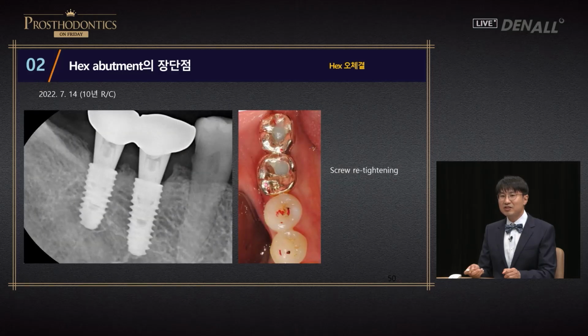Can you see this point? This is after 10 years. A screw retightening was done. If I had not found that it was wrong connection in 2012, the implant would not have been maintained for 10 years.